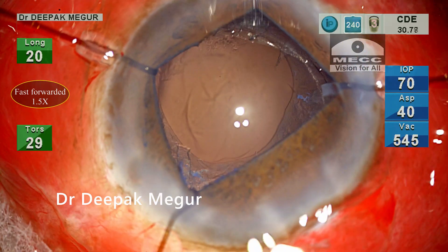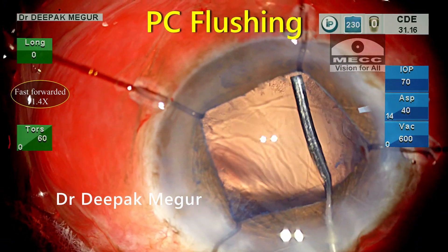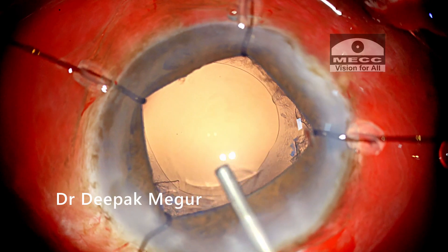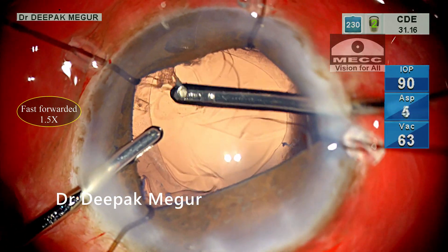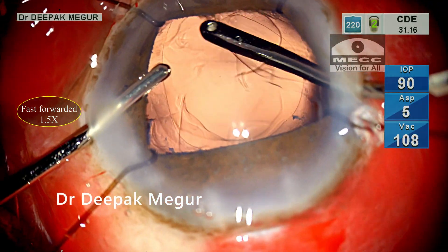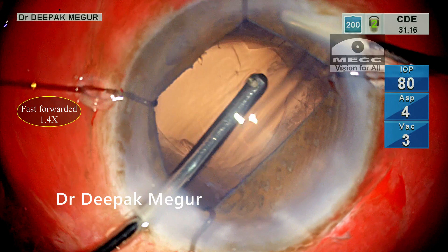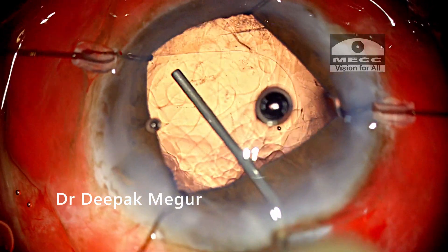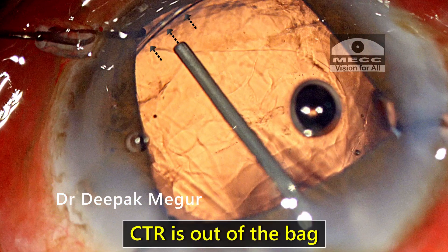Eventually all fragments are emulsified. I flush the posterior capsule with BSS to clean it up. At this stage I notice something unusual — the bag or the rhexis looks slightly eccentric, and I'm wondering why. I continue cortex extraction, and most of the cortex is removed without issue. At this moment I get a glimpse of what is wrong: a significant part of the CTR is out of the bag, which is causing the eccentric rhexis.